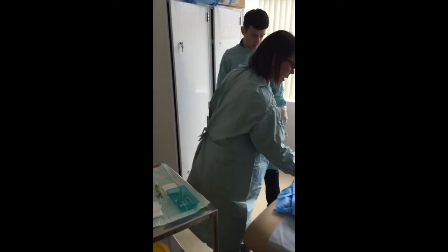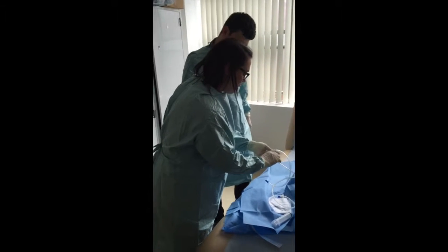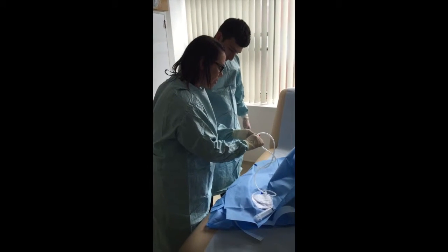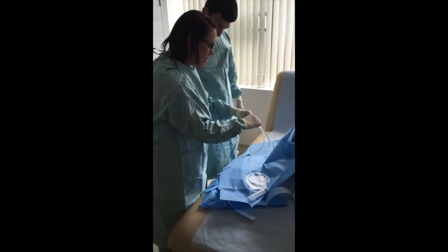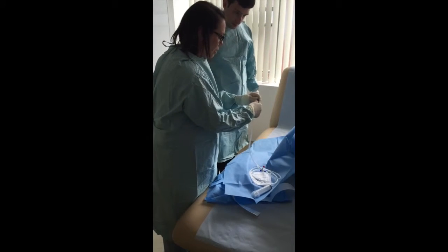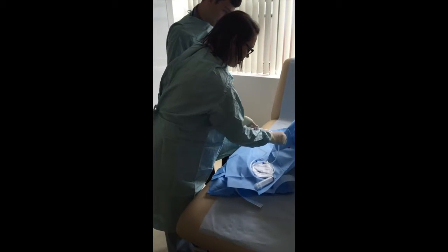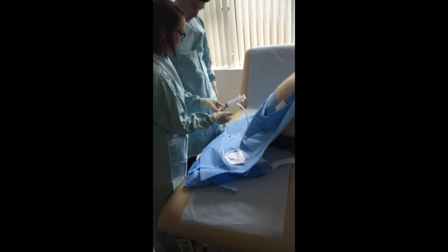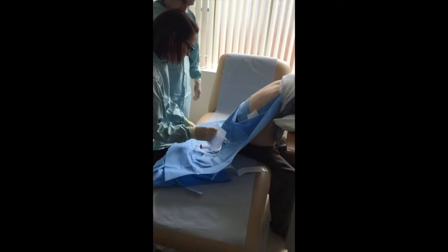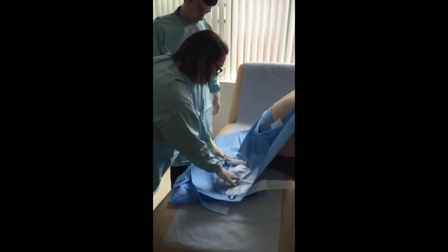And then what we're going to do is set up the kit here. So you just need to lock this down, because when it's autoclaved, your connections are slightly loose. So just take the little lock end off this and pop a syringe onto the end. Now the reason you put this on is in case you have to aspirate, but usually gravity does all the work for you. Okay. Then we'll open out this bag, that's all ready.